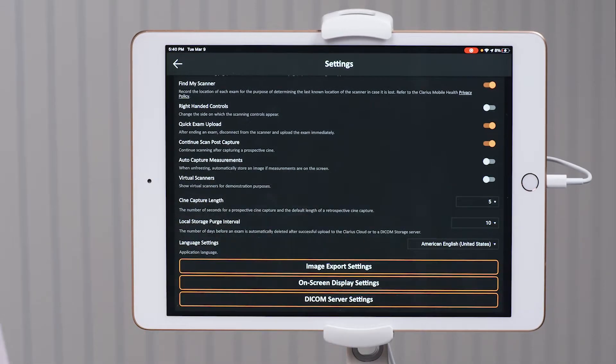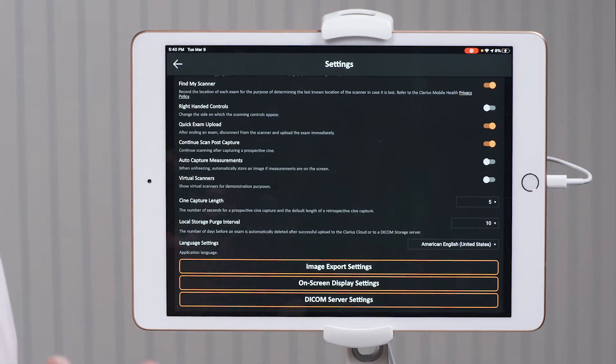The right-handed controls are a personal preference. The right-handed control doesn't have anything to do with being right or left-handed — it's all about where your images appear on the screen. When it's off, as I have, my measurements will appear on the left-hand side of the screen. When it's turned on, your measurements will be on the right-hand side of the screen.